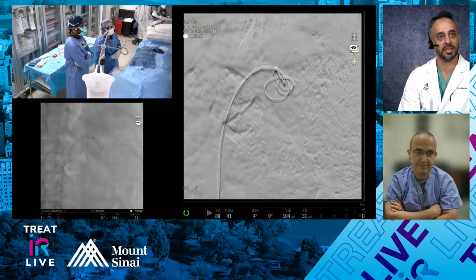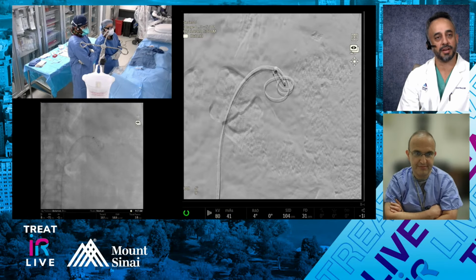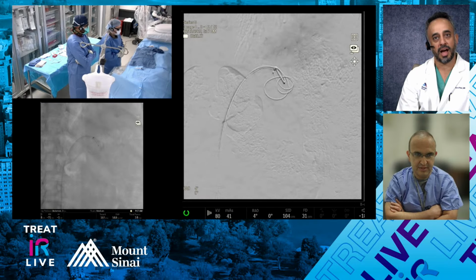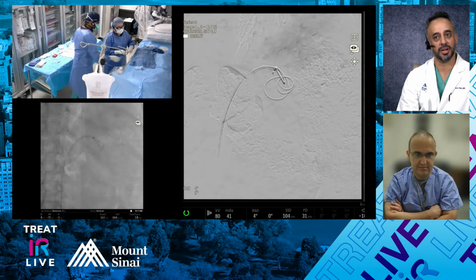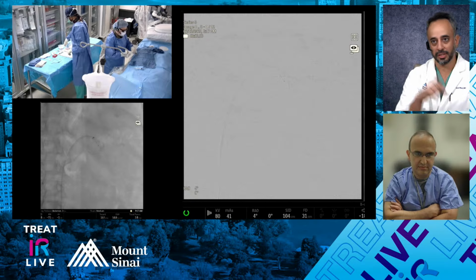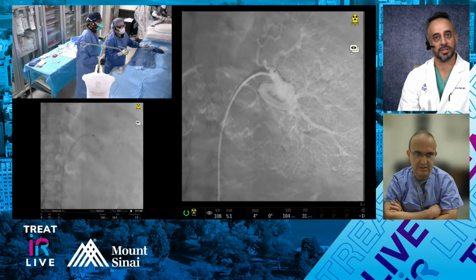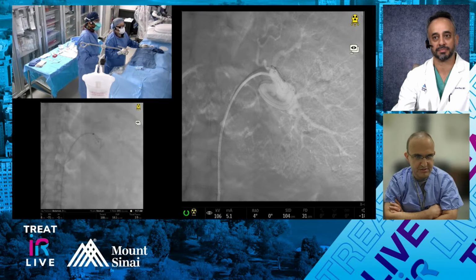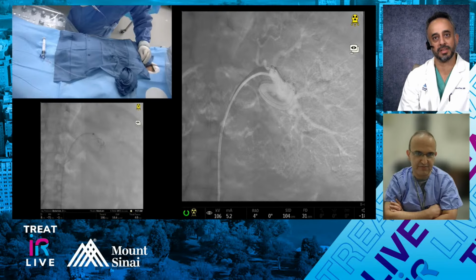There's probably going to be at least two, if not three. Unless you're going to go into every single outflow, and I've not seen a retrograde endoleak from a coiled aneurysm, meaning even if it's incompletely coiled, that the vessel fills backwards into it. Because all the flow is going towards the spleen, you also increase your infarction risk, which you want to avoid.